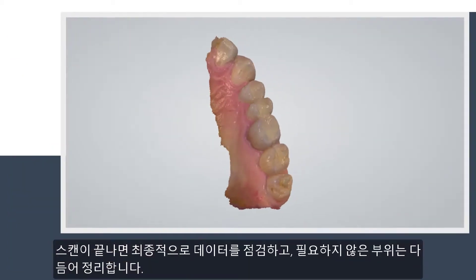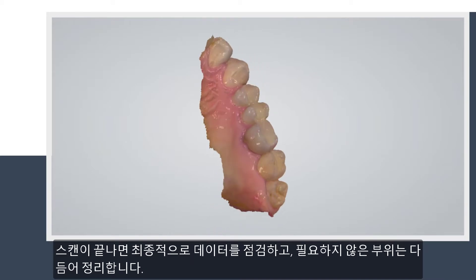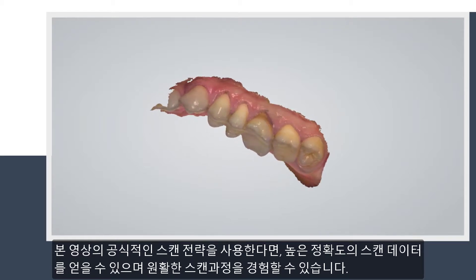When scanning is complete, you can inspect the result and prepare the scan by trimming unnecessary parts. By using this scan strategy, you will get the highest accuracy and the smoothest scan experience.